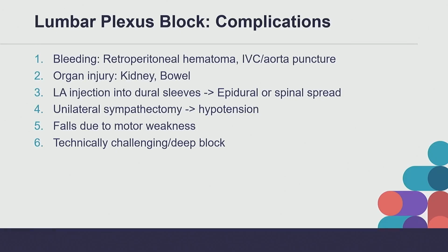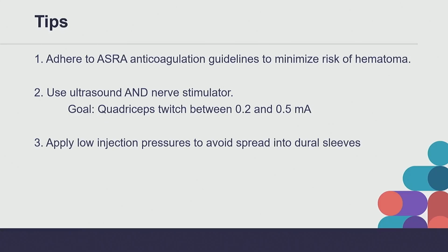And then not to mention, it is a deep, technically challenging block to do considering some of the other blocks that we have in mind. Some tips, if you are going to do this block, adhere to the ASRA anticoagulation guidelines for neuraxial technique, just to minimize the risk of hematoma.